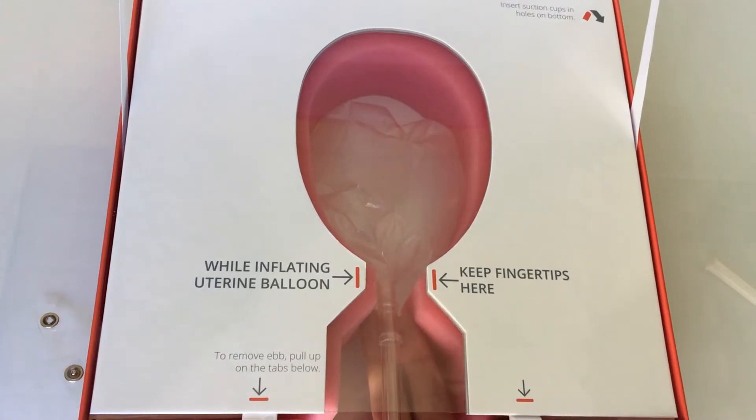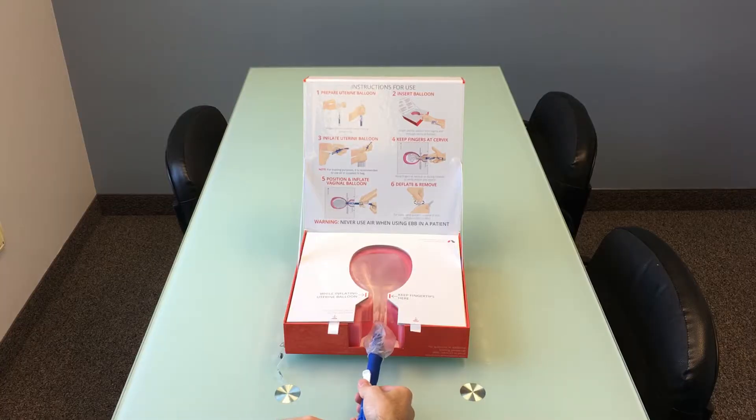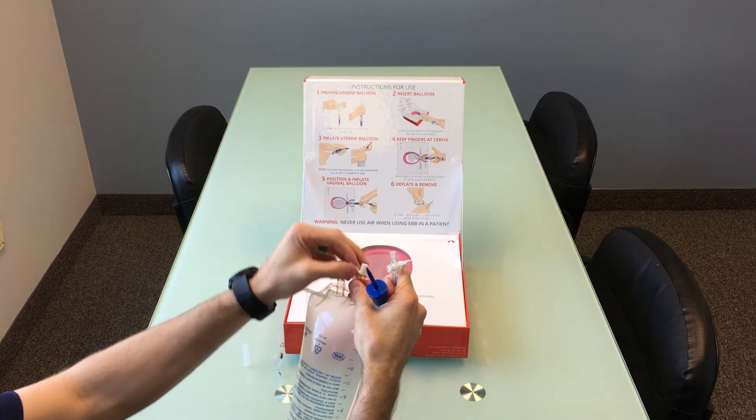Keeping your fingers at the cervix, inflate the uterine balloon until the balloon begins to push down on your fingers. Step five is to place and fill the vaginal balloon. Slide the vaginal balloon up so it's against the cervix and then inflate in the same method — be sure to close the stopcock, remove the spike, then spike the bag and gently squeeze.